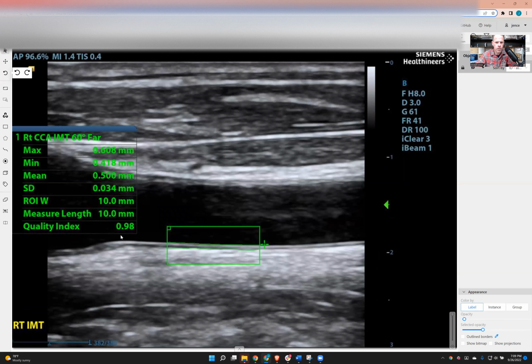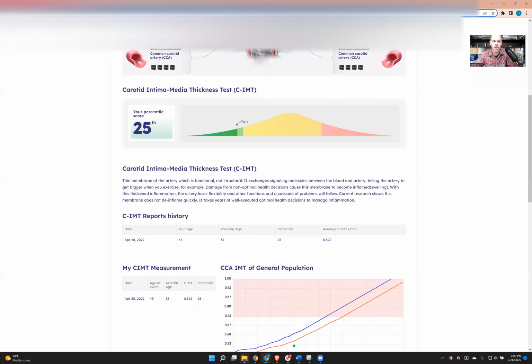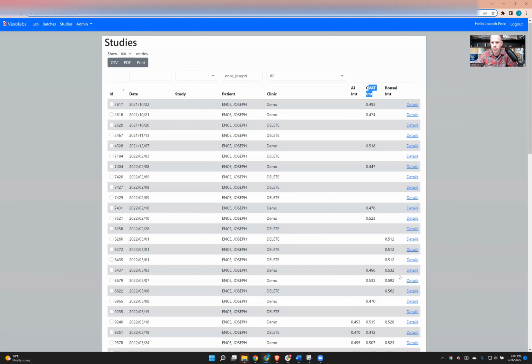And this is another measure of the intima and media. Half a millimeter, clean across. I got standard deviations. This is an FDA approved ultrasound measurement technique, and that's inside the ultrasound machine box. And then the CVAT program we're measuring right now, we draw these constraint bars and we get a good measurement. These are saved and brought back to a screen like this inside the lab where we can generate reports.